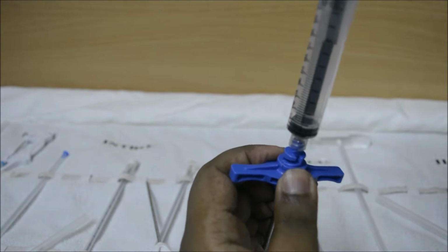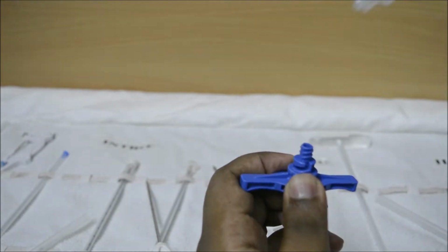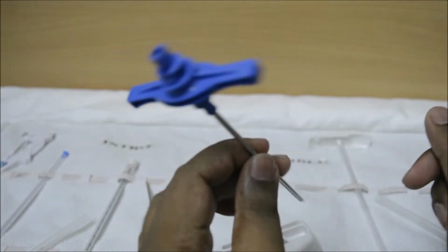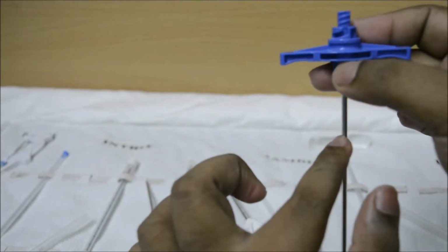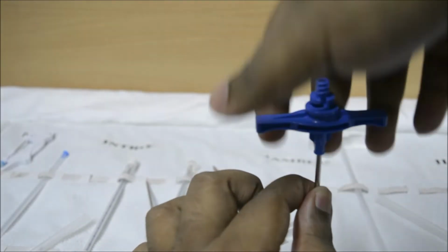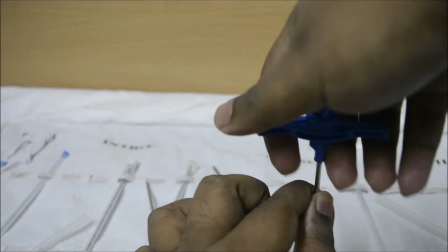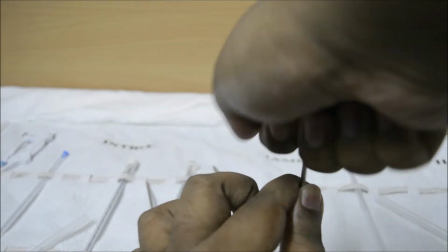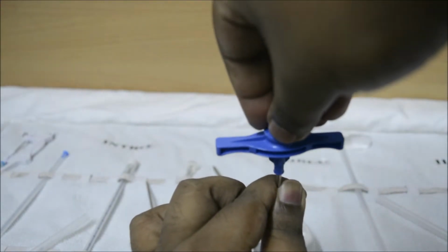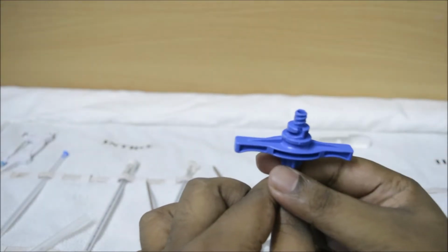So if, for example, the doctor wishes to collect the bone marrow fluid, he takes this luer lock syringe and collects the specimen into the specimen collection tube. That part is done. Now the needle along with the cannula is inside the body. For example, this much part is inside the body. Now the solid bone marrow needs to be collected. So there we perform a different mechanism called trephining, or the trephine. The needle is pushed inside hard using 180 degrees left and 180 degrees right, and then pushed further inside. Now it reaches far enough so that it can collect the solid bone marrow.